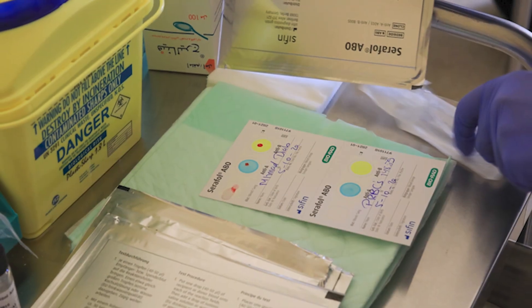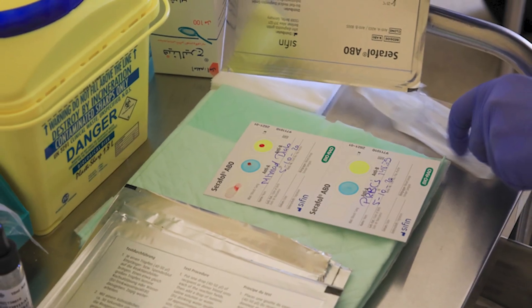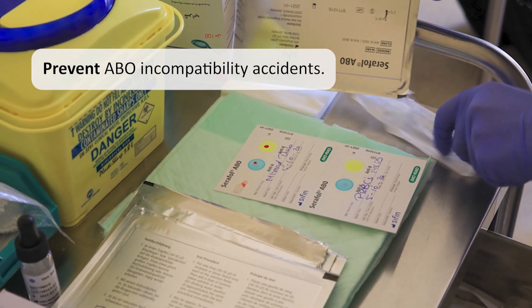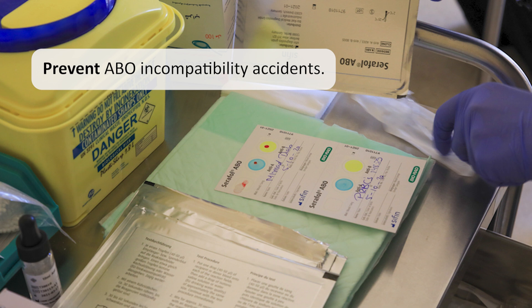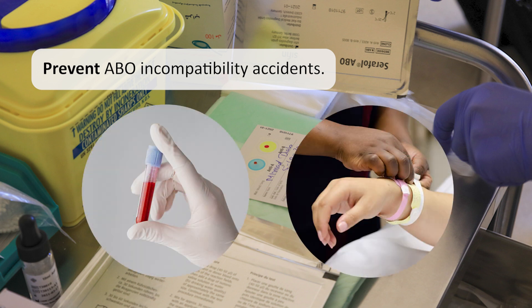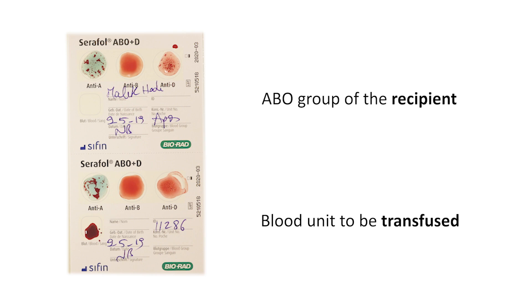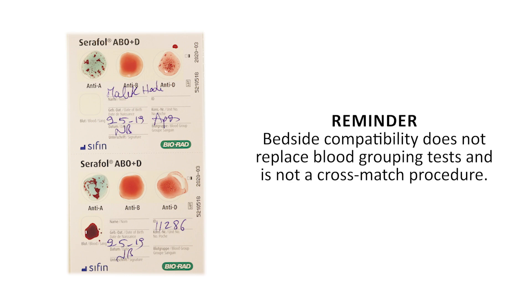The ultimate ABO compatibility check at the patient's bedside is intended to prevent ABO incompatibility accidents that result from mislabeling of tubes or blood units or from misidentification of patients. The test consists of checking both the ABO group of the recipient and that of the blood to be transfused. Reminder: bedside compatibility does not replace blood grouping tests and is not a cross-match procedure.